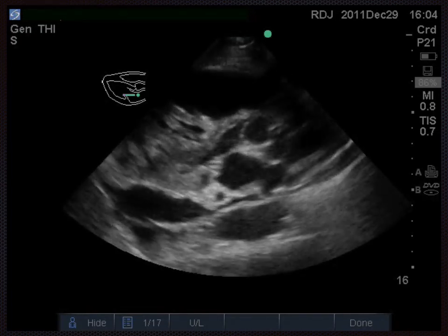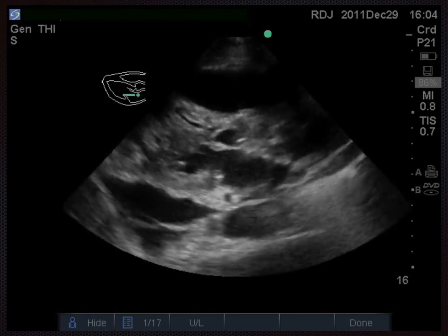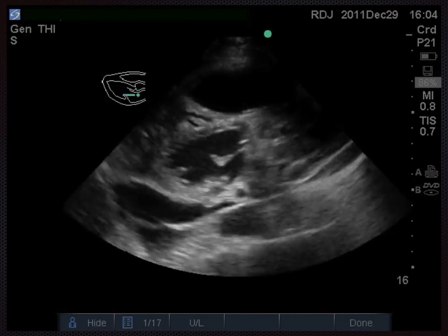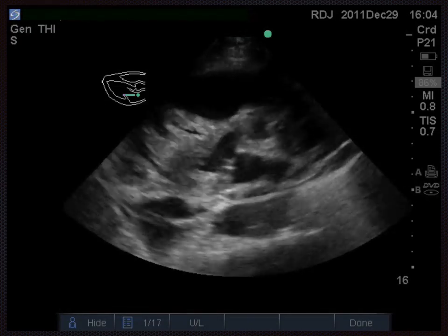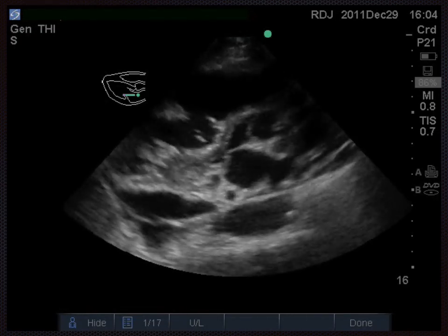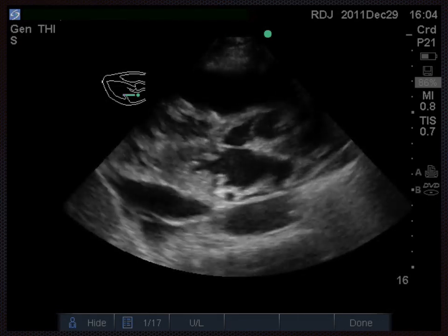Okay, can we see the aortic valve above and to the right? Well, it's not clearly seen because this clip keeps wandering off the axis of the aortic valve. So I think it's reasonable to say that you haven't fully been able to see the aortic valve in this view to make an assessment of whether or not it is thickened or whether it's moving normally.